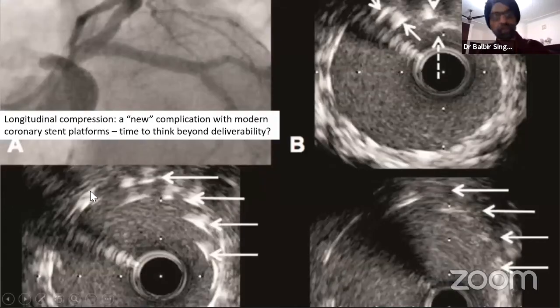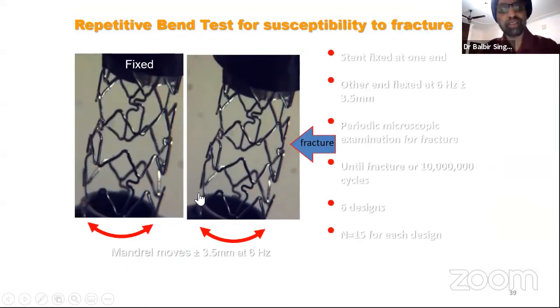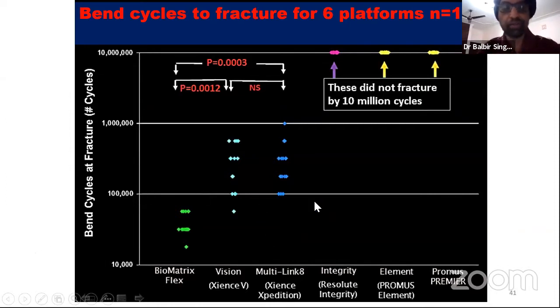So how do we diagnose on intravascular ultrasound a longitudinal deformation or a deformation of stent? You see multiple layers of the stent, which can clearly tell you that this stent has been deformed. Now, this is what a fracture looks like on a microscopic appearance, that you see a connector going off here. You see not only the fracture, but the strut has also gone away. So this is a bend test to look at how fractures happen. And this has been seen with many stents. And bench tests have told us that some of the stents have very good properties to prevent fractures.